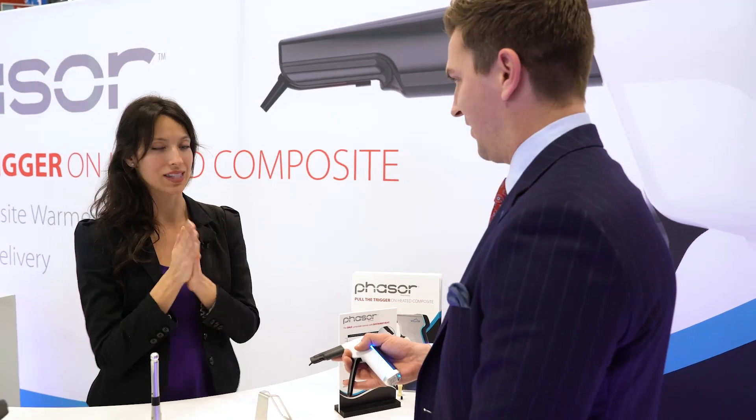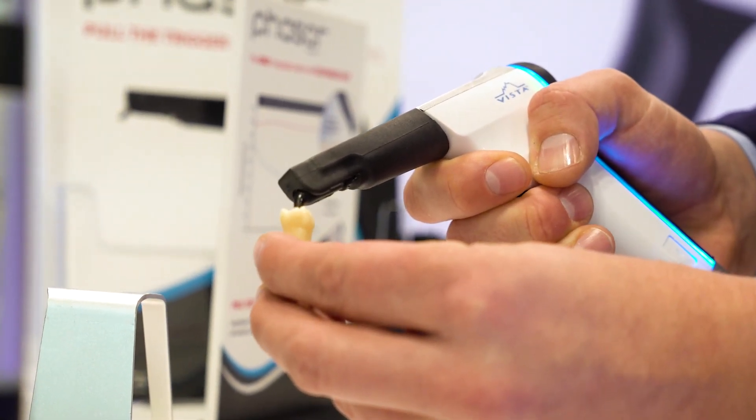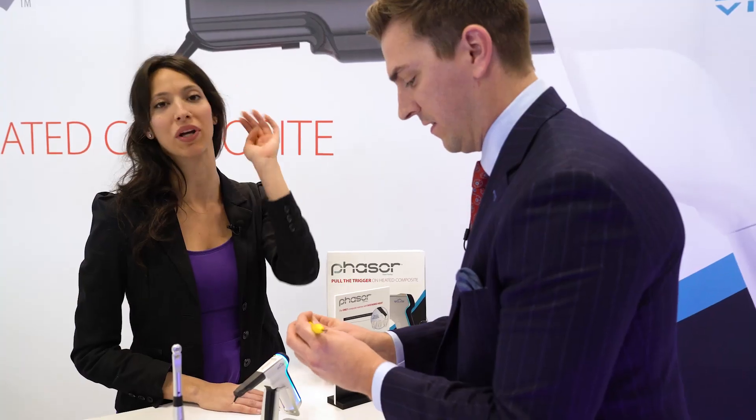We're ready to go. When the lights turn blue, we're ready to go — solid blue light, ready to rock. You can see how easy it is — I'm very gently squeezing it. Nice and easy. It's not like poking anything. It's just gently packing. Nice and creamy.